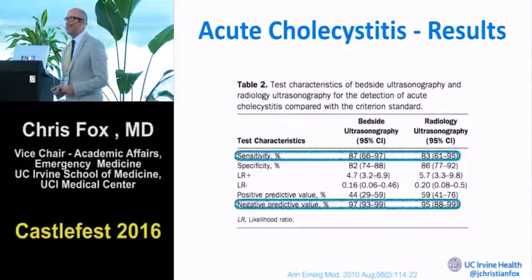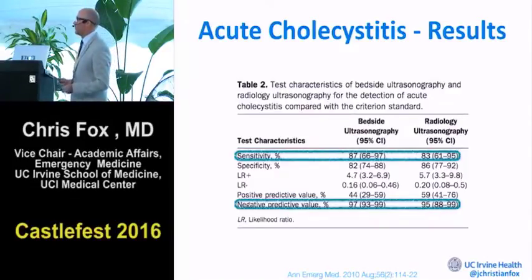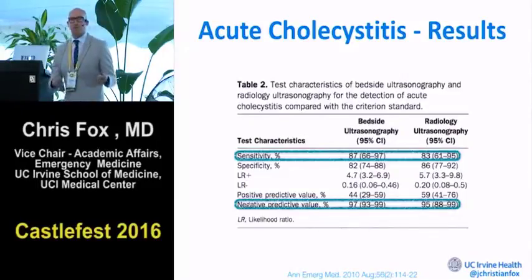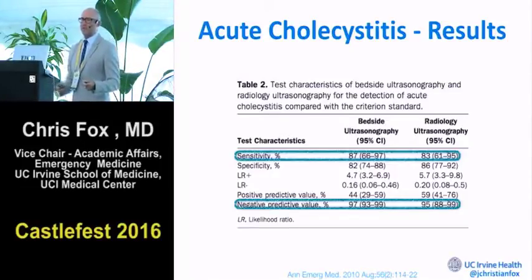And so this is just one of those things where at the time we did the study, we were having some drama with radiology, and when we were able to show them some of this data, it was, hey, look, you guys, we're kind of on par with each other here. Maybe we're a little bit better on the sensitivity. Maybe you guys are a little better on the specificity, here's their specificity, a little higher, 86 versus our 82. We're basically the same here. So let's knock off this business about the patients not getting as quality of an ultrasound when 43 of my docs are doing this in my emergency department.